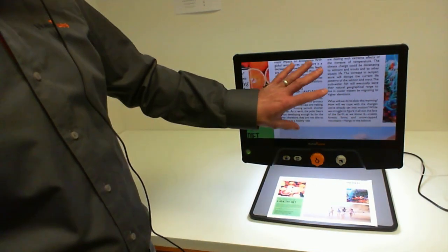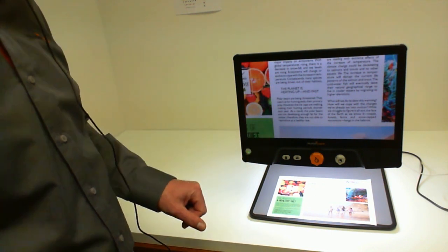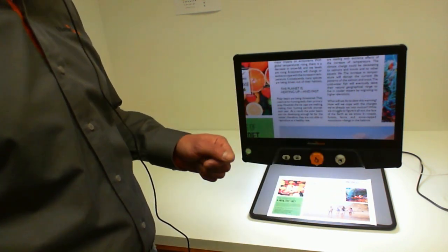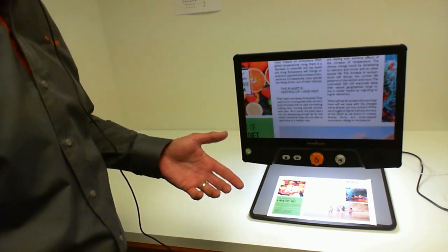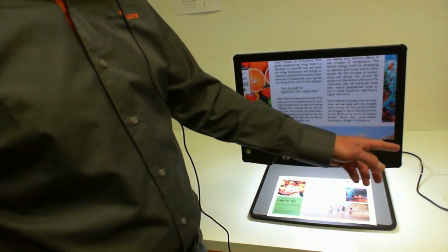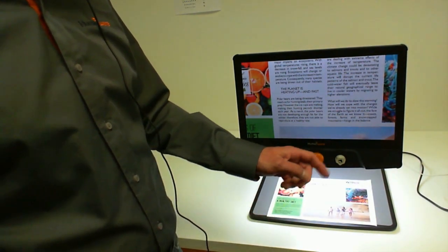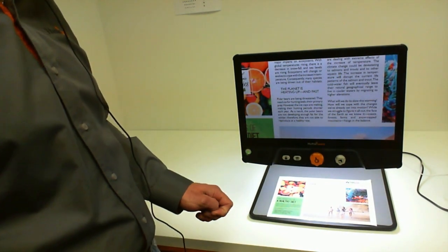There is a touchscreen enabled, speakers in the front of the device, a USB to connect to a computer to share files with the computer. Also on the side, there is a USB port to connect a USB stick with a headphone jack.